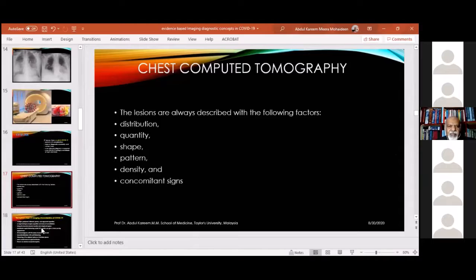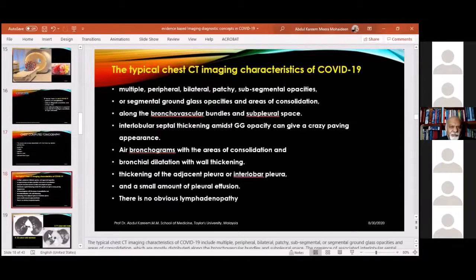Okay. In the CT scan, we can see clearly where the lesion is, what the lesion is, how it is distributed, and how much the lung is affected, whether it's completely damaged or it is limited or focal there. What's the shape of the lesion, whether it is associated with any other disease in the lung. So all these things you can see in CT scan.